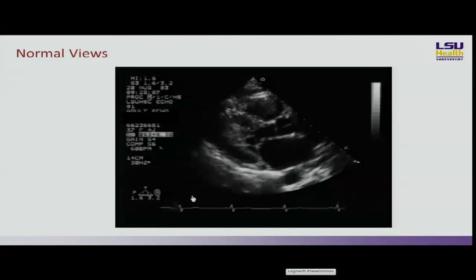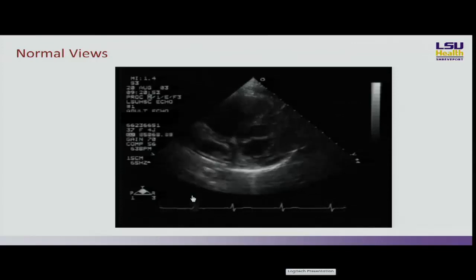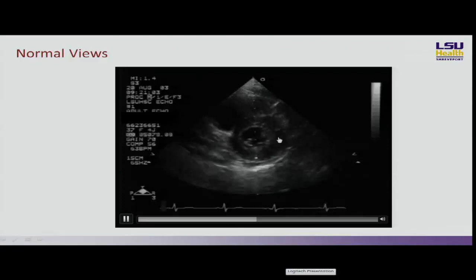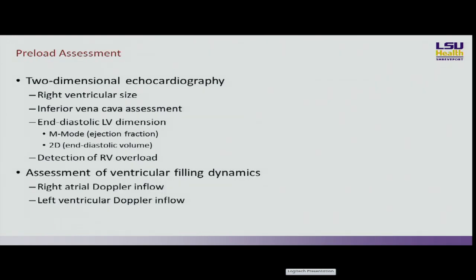Good. So we're looking at contractility. Here we can see the septum is contracting well, and the posterior wall is contracting well. This is the short axis. You can see that it's going by very quickly. But you can see that it's contracting symmetrically, that it's got a good ejection fraction just by eyeballing it. I mean, just from experience, I can tell you that was about a 60% ejection fraction. So once you get used to looking at these things, you can get a lot just by eyeballing and not have to sit down and make all the measurements that may otherwise be necessary.